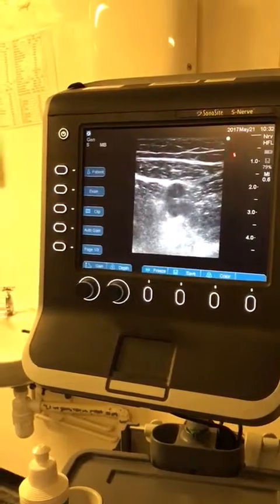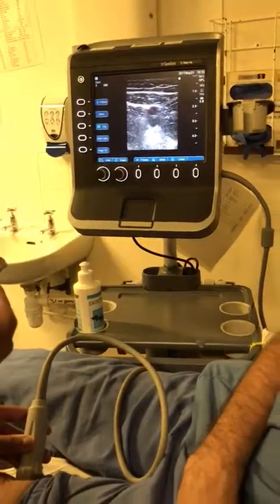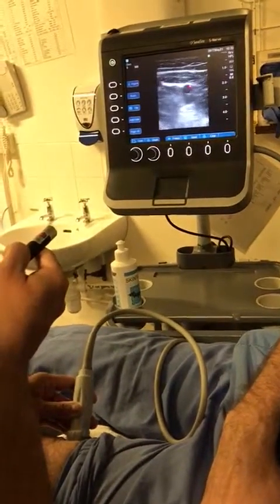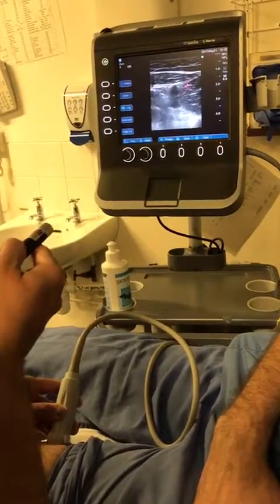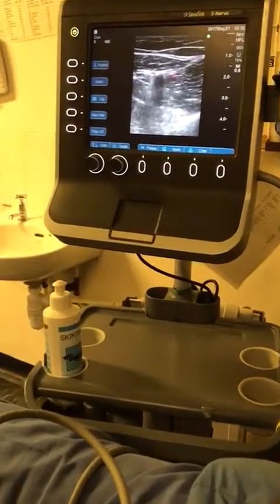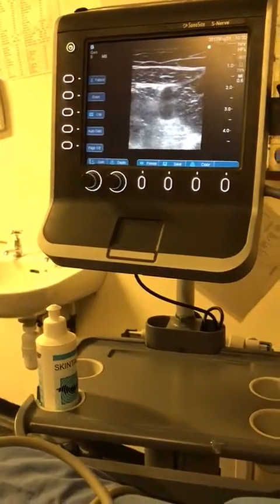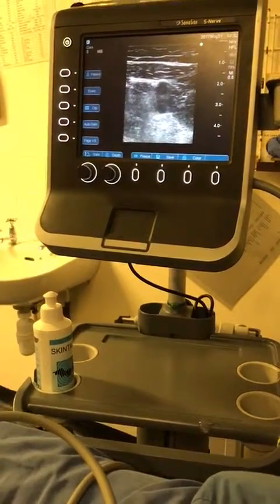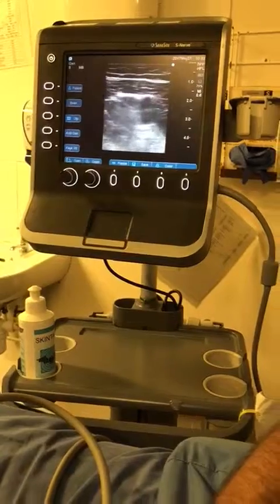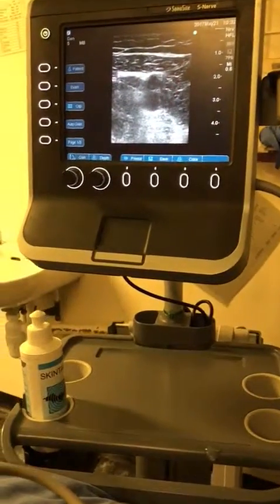So if you bring the needle in and pierce this membrane, the local anesthetic will reach your saphenous nerve. It will also reach the nerve to vastus medialis, which will be here — as you can see if I go up, the nerve to vastus medialis is there. And you'll also catch branches of your obturator nerve. So the approach is lateral to medial: pierce the vastoadductor membrane and inject the local anesthetic around the artery, and you will get a lower femoral triangle block.